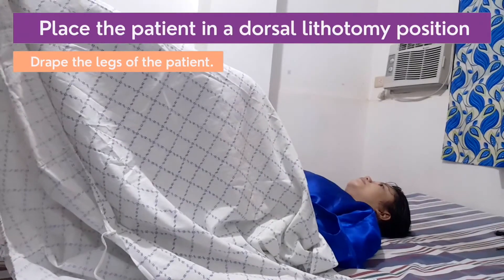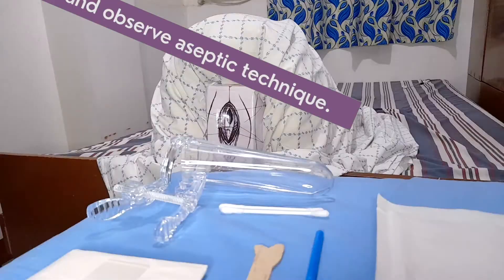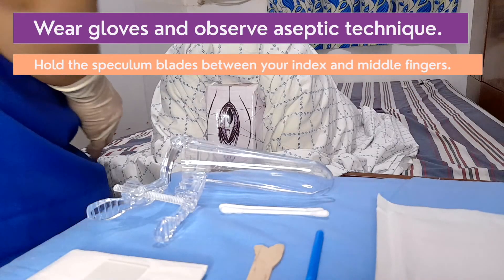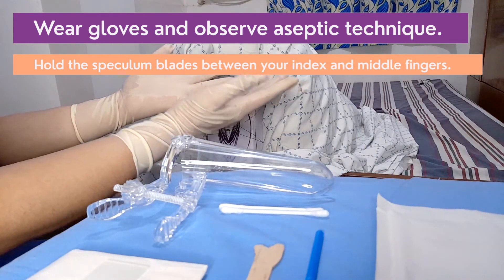Place the patient on a dorsal lithotomy position. Drape the legs of the patient. Wash your hands and wear the prescribed PPE. Wear gloves and observe aseptic technique throughout the procedure.